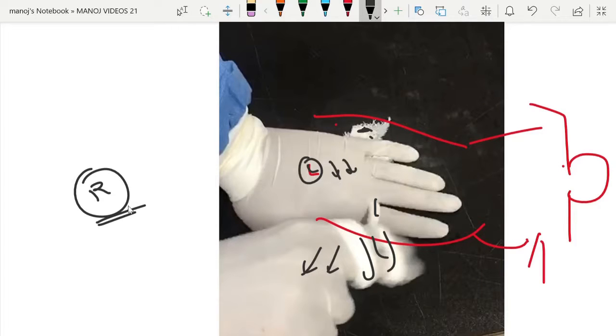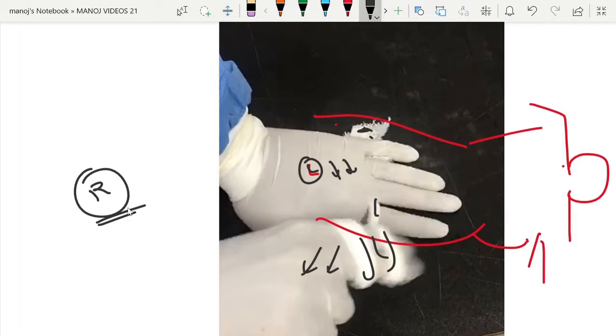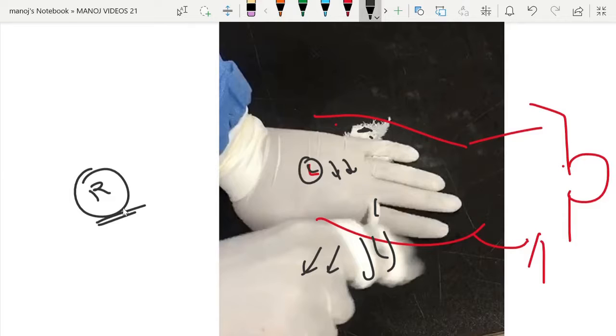Usually these catheters are very resistant to break, so it won't break. Only while dissecting the cuff, if you are using a blade and it damages the cuff, there is a chance of breakage of the catheter. So that's why dissecting the superficial cuff is very important.